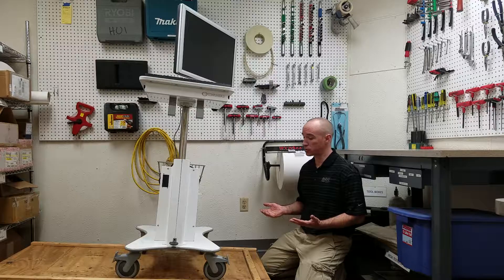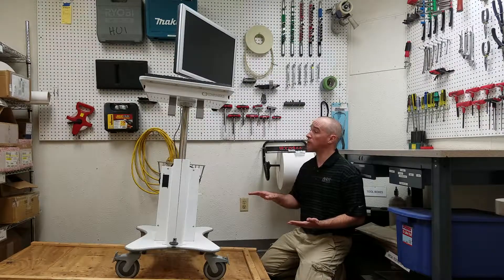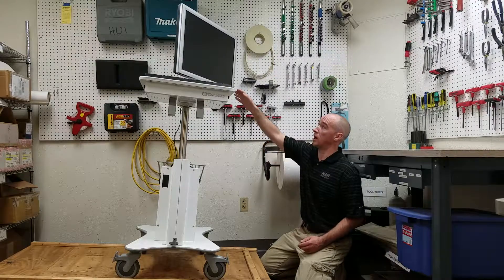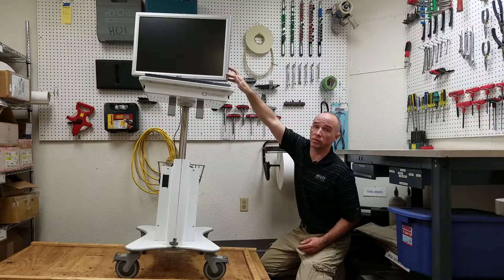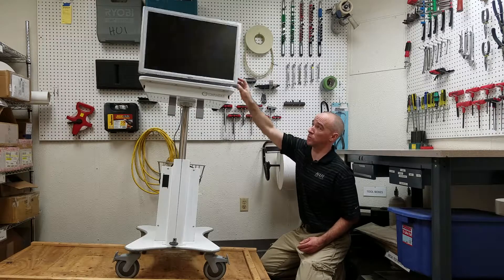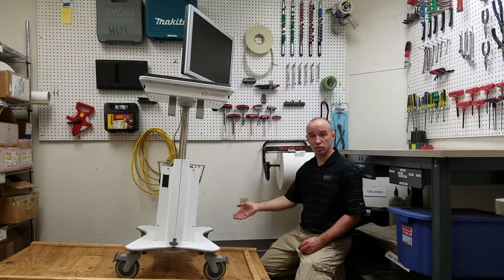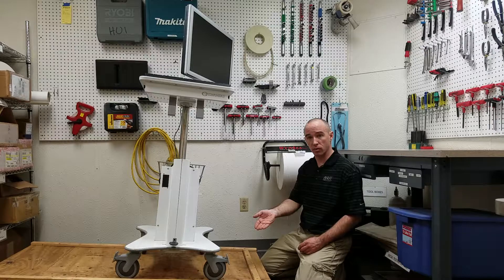The non-transport mode test includes lowering the ramp down to five degrees and increasing the center of gravity by moving the cart up as high as it can. In this case, we have a monitor that swivels, so the worst case would be the monitor coming over towards the downhill side. We have directional wheels, so we will put those in the worst-case orientation, then lock the wheels and check for creepage.